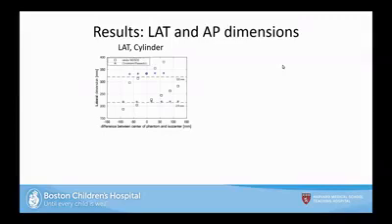But the other approaches, because they take into account the table height, you can see that it flattens out the data, but still not exact. So in our approach, because we make less assumptions, these points here line up with this dashed line here, which is the true dimension of the patient. So what I conclude from this graph is that our magnification method, because we make less assumptions, will actually agree with the true dimension of the phantom.